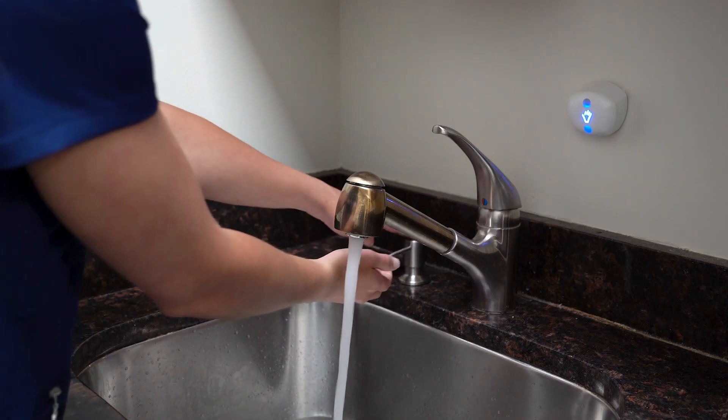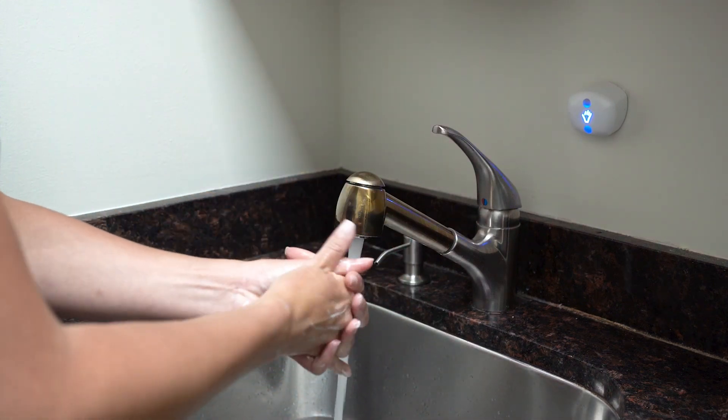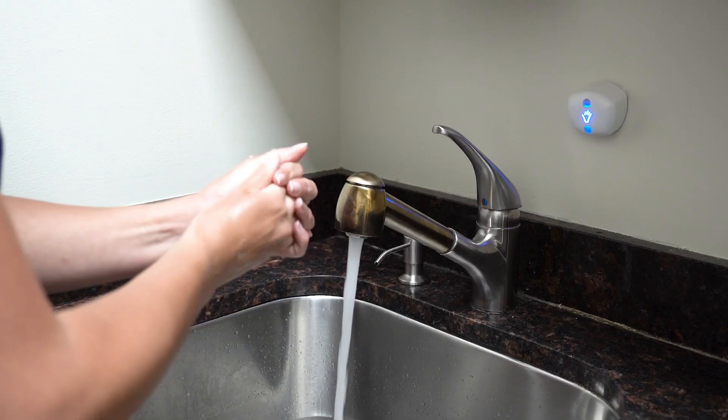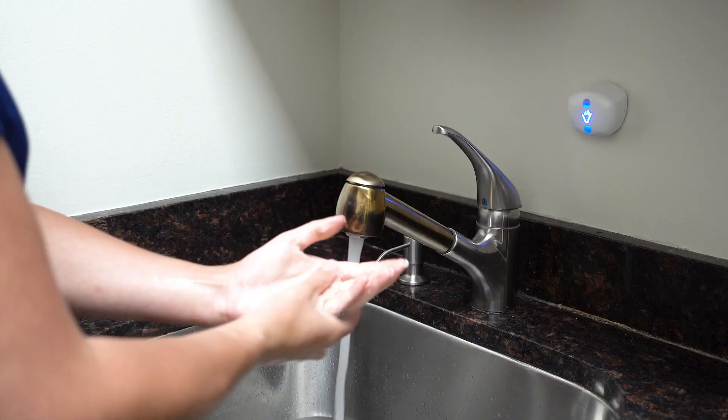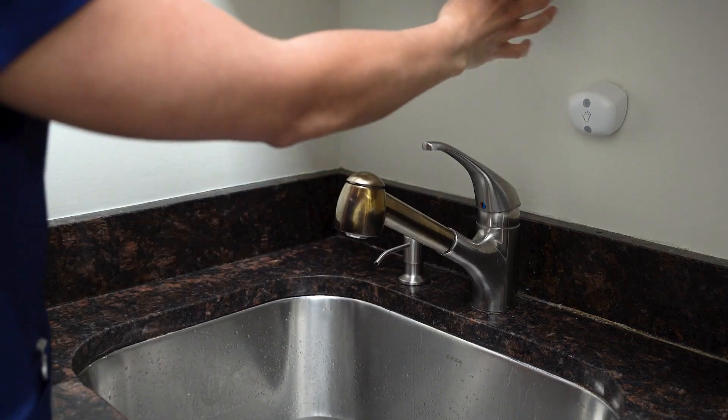As soon as the user breaks the field of the trigger sensor, the light will begin to pulse blue. As the user continues to wash their hands, the blue light in the sink sensor will increase in frequency, pulsing faster and faster until the end of the 20-second session when the light will turn green, indicating to the user that the 20 seconds is over and their hand wash is complete.